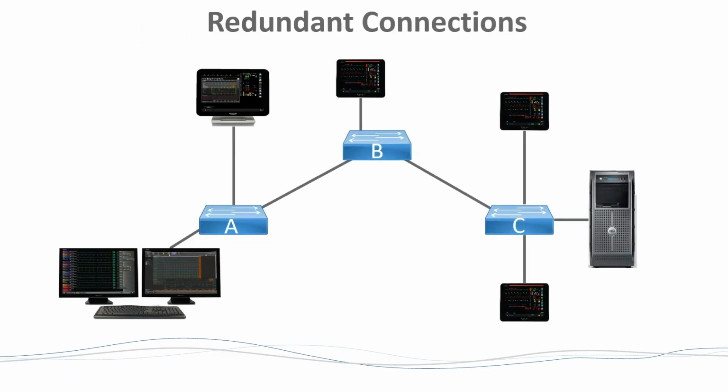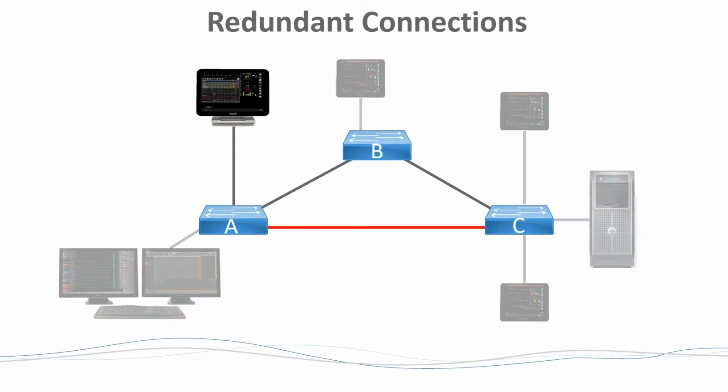So here's the thing I talked to you about, right? I just built my awesome network. It's going to these 3 switches. You know, I got floor 1, floor 2, floor 3. Everybody's cooking along. And then somebody says, well, you know, if that switch on floor 2 dies, now I can't communicate between floor 1 and floor 3, and we're down for 2/3 of the hospital. That's a problem. Like, oh yeah, I know what I'll do. I'll just connect that, right? So you can see now that switch B is gone, I can still connect A to C, right? Which seems great. It is great.